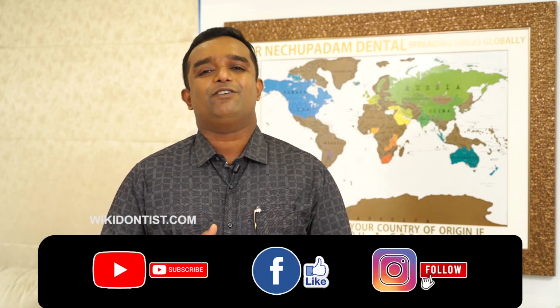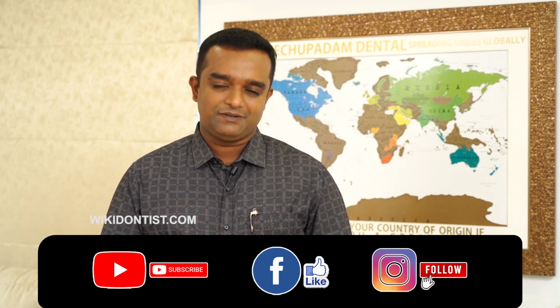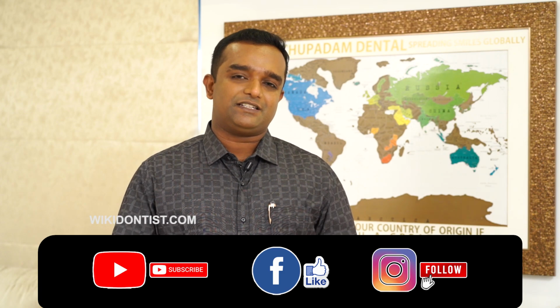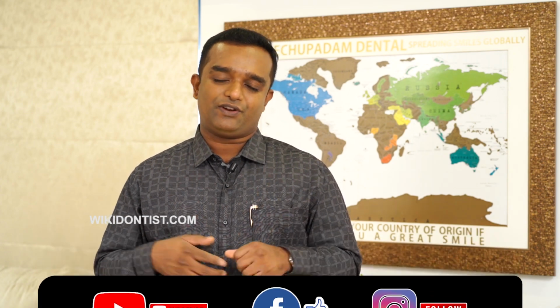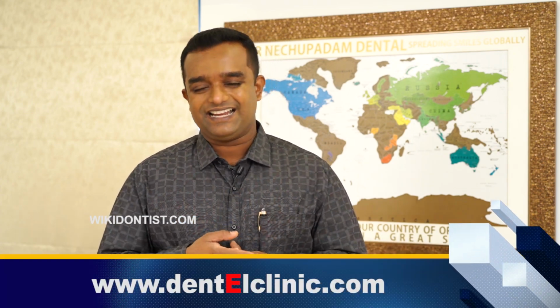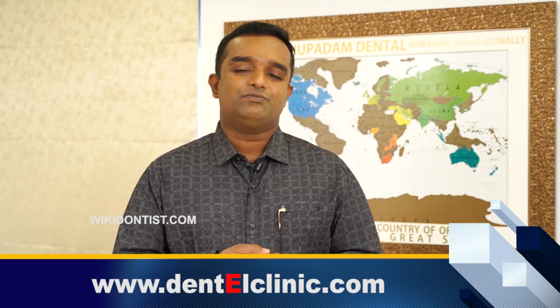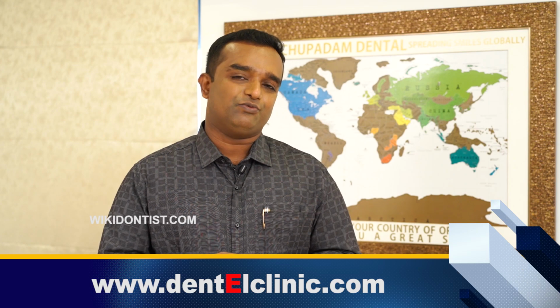So please understand that retainers are things that will keep the tooth in that position, or retain the position of the tooth. It is not an active appliance most of the time. We can use it as an active appliance within its own limitations, but it cannot be used for large amounts of tooth movement. It needs fixed orthodontics, or putting of brackets, to move teeth in very large movements.